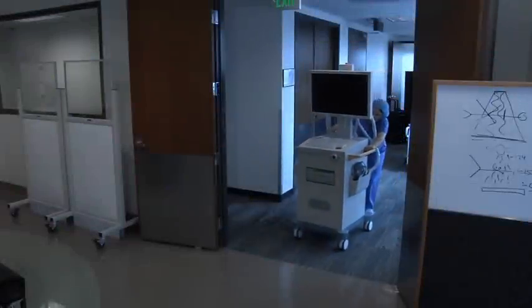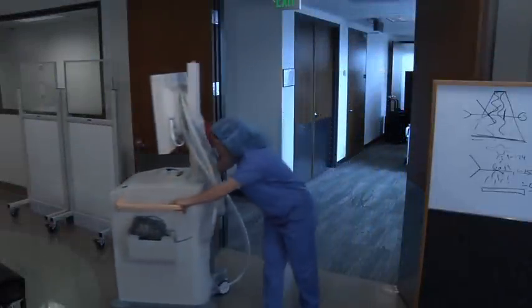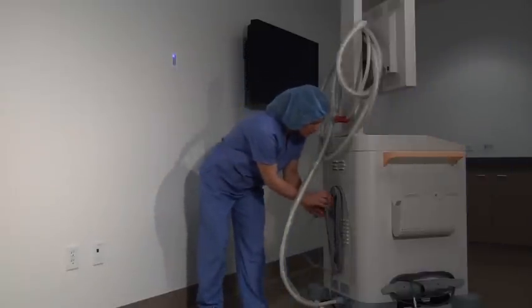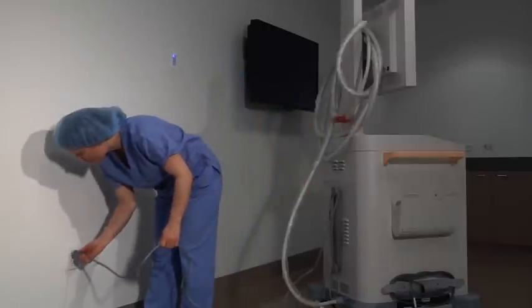Next, bring the mobile viewing station into the operating room. Now we'll connect the system. On the back of the mobile viewing station is a power cable. Unwrap it from its cable wraps and plug it into a main power outlet.